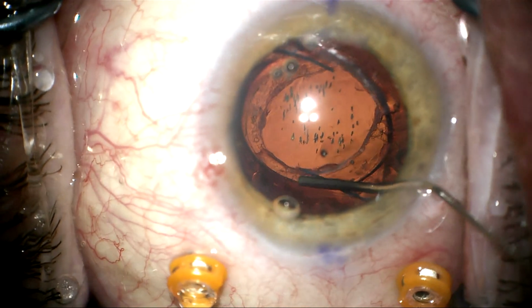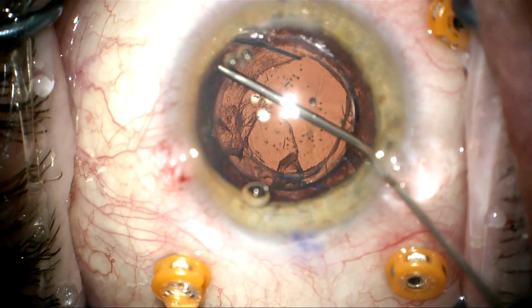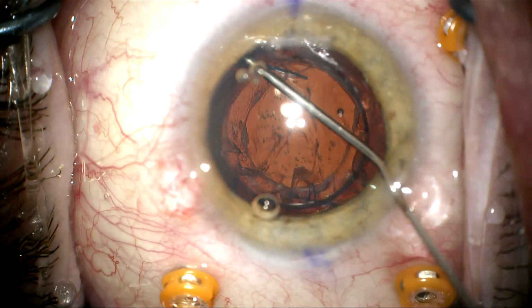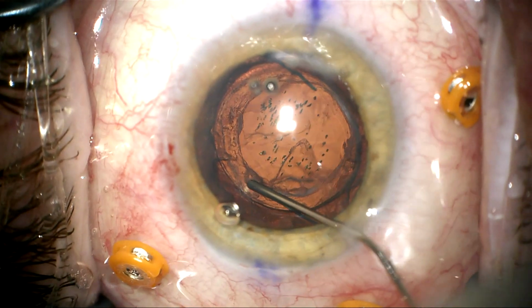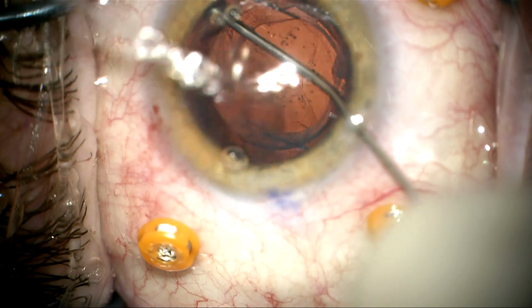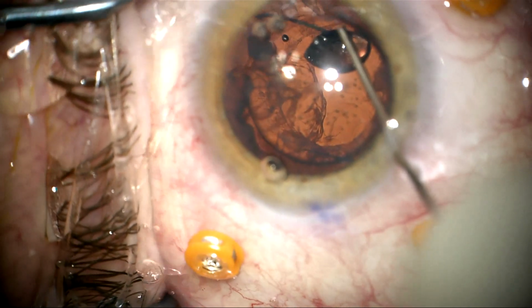Here I can see the anterior capsule starting to separate as I work my way around. There's a lot of Soemmering's ring lens material in here that's being kicked up as I inject, and we'll deal with that later. So now I'm using the viscoelastic to separate the anterior and posterior capsule 360 degrees so I can free up this lens and remove it.